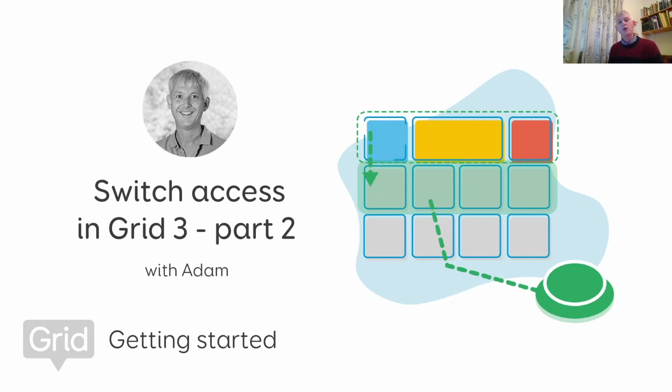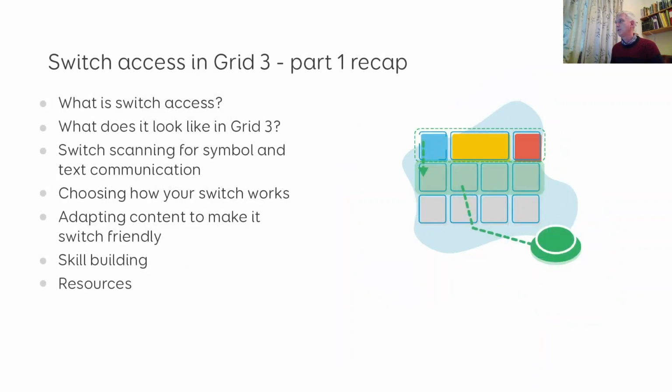Okay, so one of the things that I would advise you to do if you are new to this is to go back and look at part 1 of our webinar. So in part 1, one of the things that we looked at was, let's just bring up a slide to show you some of the things that were covered.